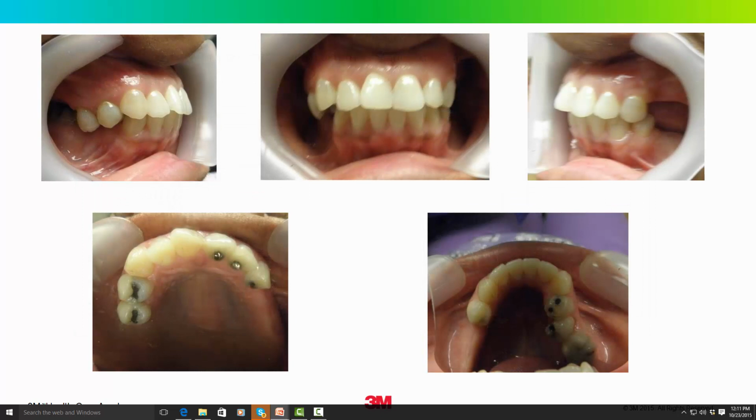This case came in for consultation. It's a Brodie bite on the lower right side. You see the lower arch is collapsed. Now normally you would just put some brackets on it and attempt to get vertical stops on that right lateral segment.